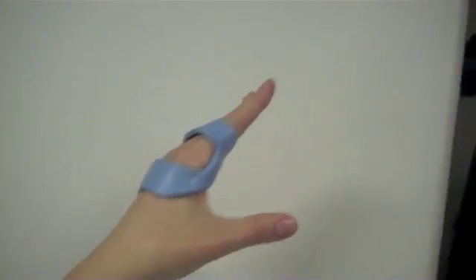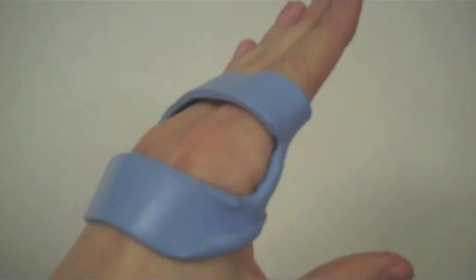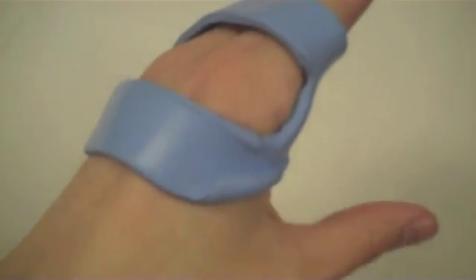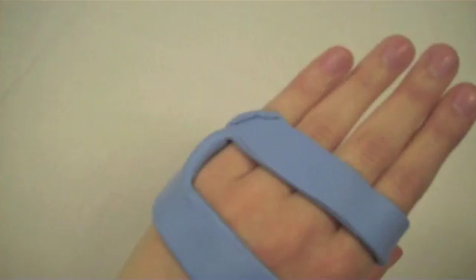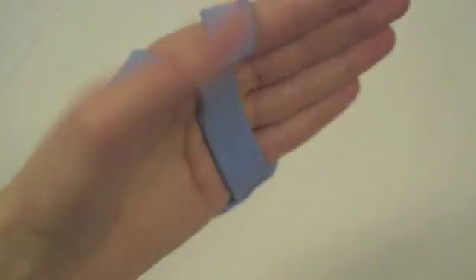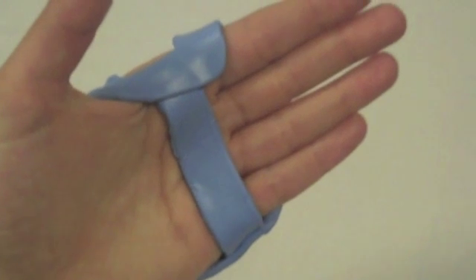Note how the splint is rolled out by the first web space to allow for thumb opposition and flexion. The bar should cover the palmar aspect of the MCP joints.